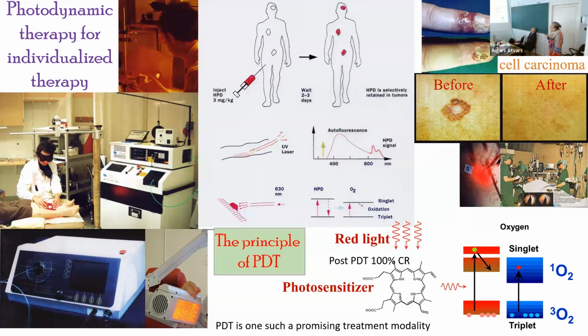So the principles you have here, and I show some of the development of lasers here, from the very complicated system that we used at the physics department. Then we got another laser, which was the next step. It's a neodymium YAG laser, frequency doubled, as you see the green light coming out here, pumping the dye laser on top. So that was a complicated system, but it worked well.